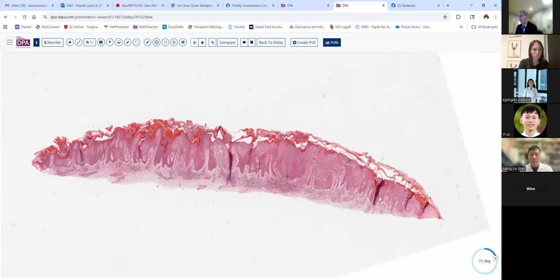But in general, would you think that this type of proliferation, sort of even across the whole spectrum, is more likely to be benign or malignant? I think that would be a benign lesion. Yeah. Although some cancers or in situ lesions can have a uniform extension like this, like vulvar neoplasias and so forth, in squamous cancers or basal cancers there's more irregularity to that.